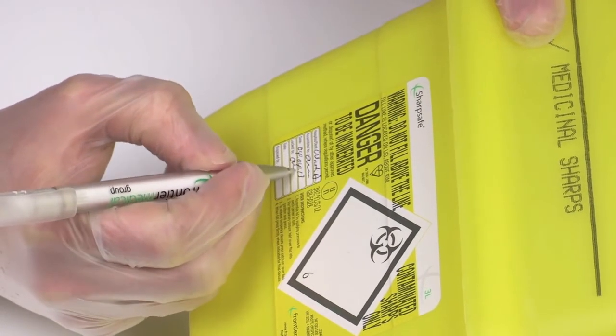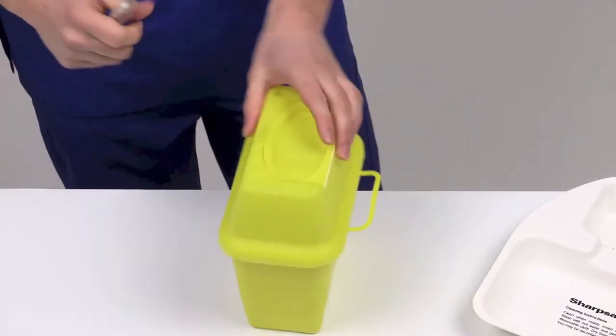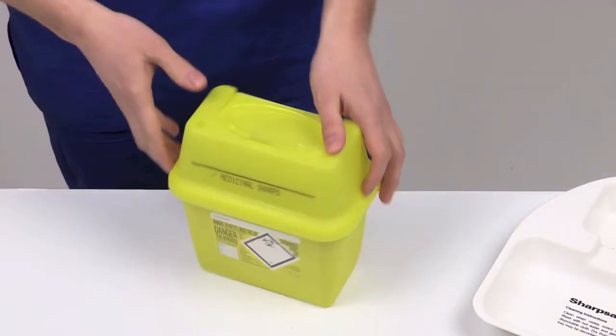Fill in the details on the label with your name and the date the container was sealed. The SharpSafe container is now ready for collection and disposal.